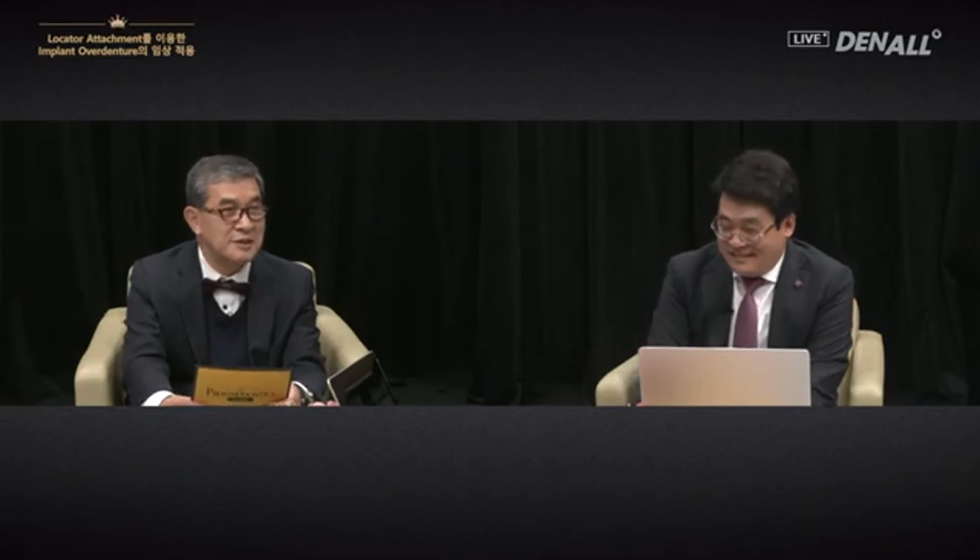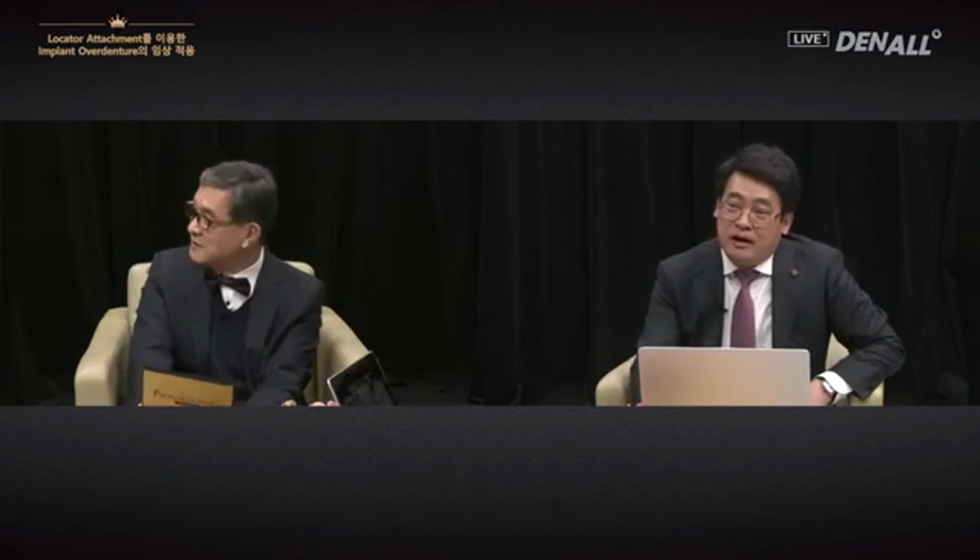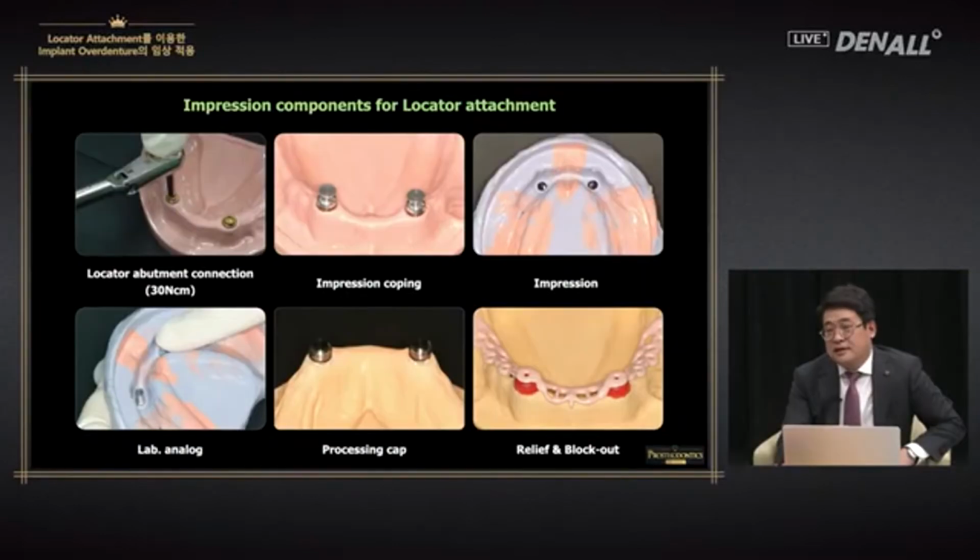I utterly agree with Professor Joe. Most people do it within the oral cavity. It's very rare to have it done at the lab. If you look at the catalog of a vendor, it is introduced like this. Yet personally, I don't do it like this.